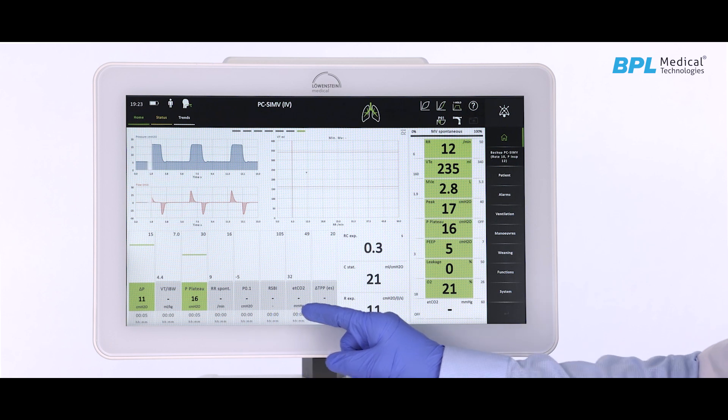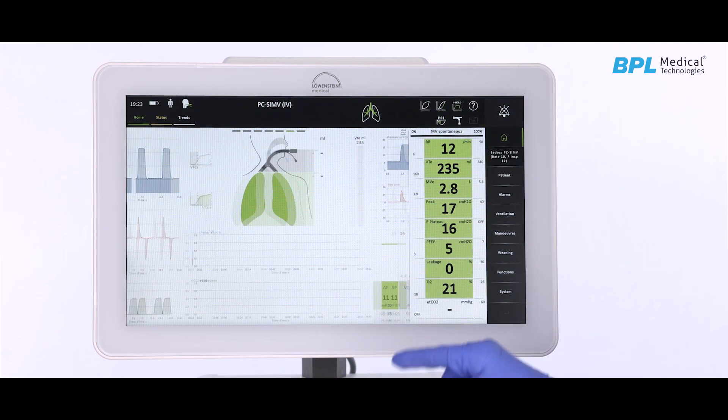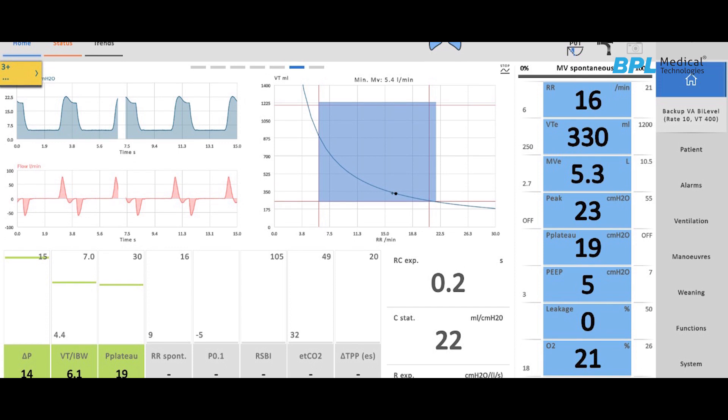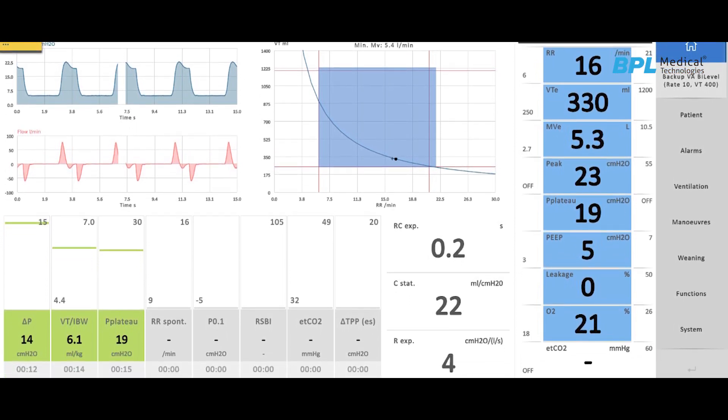The agile user interface with configurable screens displays elaborate data which is just a finger swipe away. The instant view technology gives the user an intuitive grasp of the patient's situation by displaying crucial parameters instantly.